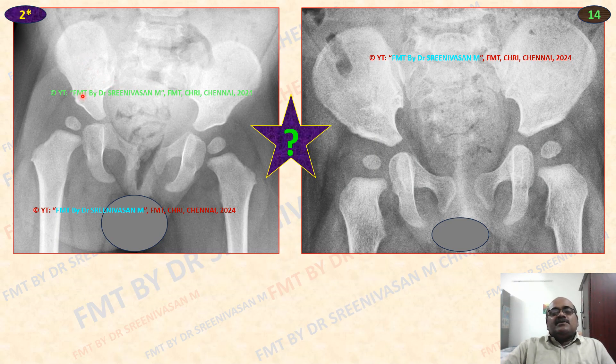In this X-ray on the left side: ischiopubic ramus not fused, tri-radiated cartilage not fused. But the head of the femur has appeared, not fused. Greater trochanter not appeared, lesser trochanter not appeared. So: more than 6 months (head of femur appeared), greater trochanter not appeared means less than 4 years — this is the narrowest range: more than 6 months, less than 4 years.